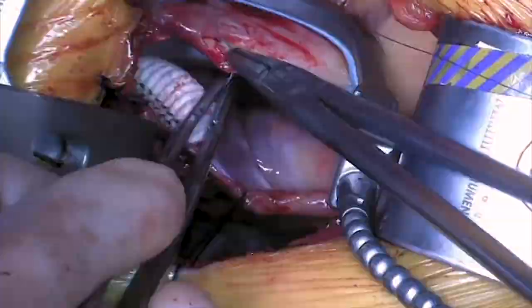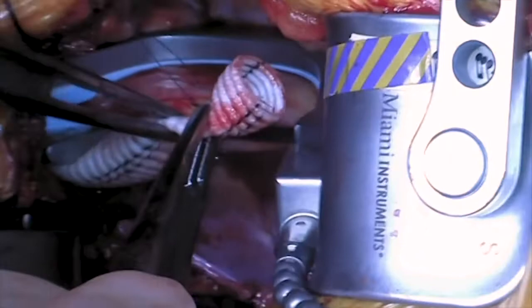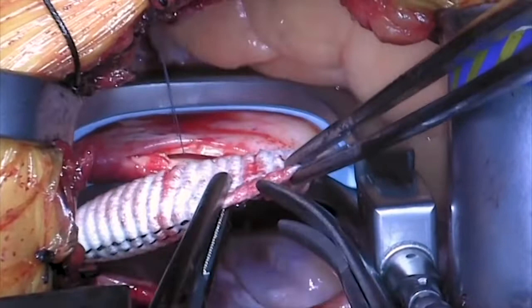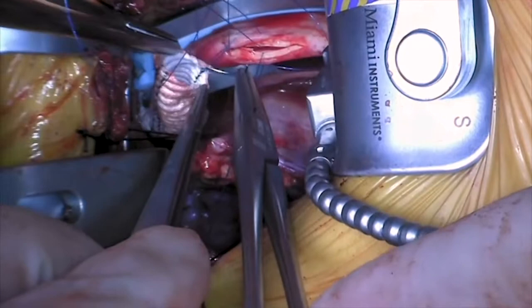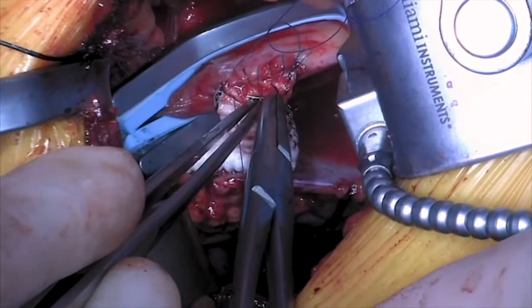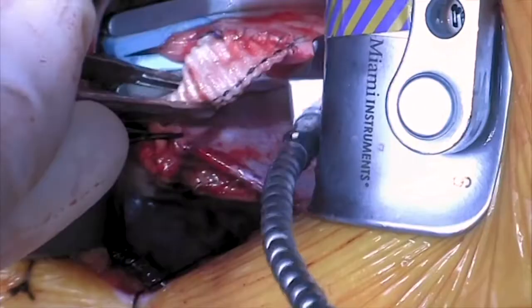As a side note, we would like to remind our viewers that we routinely heparinize our patients to an ACT level above 250 prior to any clamping. The graft is then beveled and fashioned in preparation for our anastomosis. Our proximal anastomosis was constructed using 3-0 Prolene in the standard fashion. The clamp is removed and the anastomosis checked for leaks.